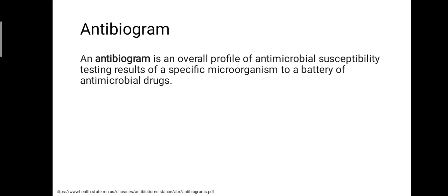So first of all, what is an antibiogram? An antibiogram is an overall profile of antimicrobial susceptibility testing results of a specific organism to a battery of antimicrobial drugs that we generally use. So in simple terms, what is it?